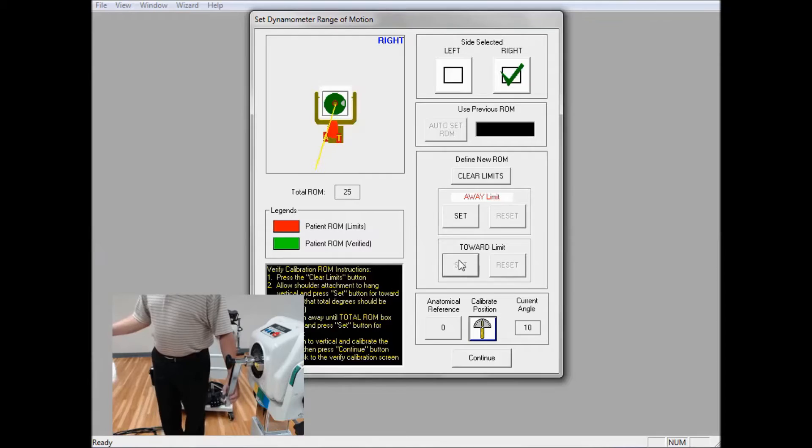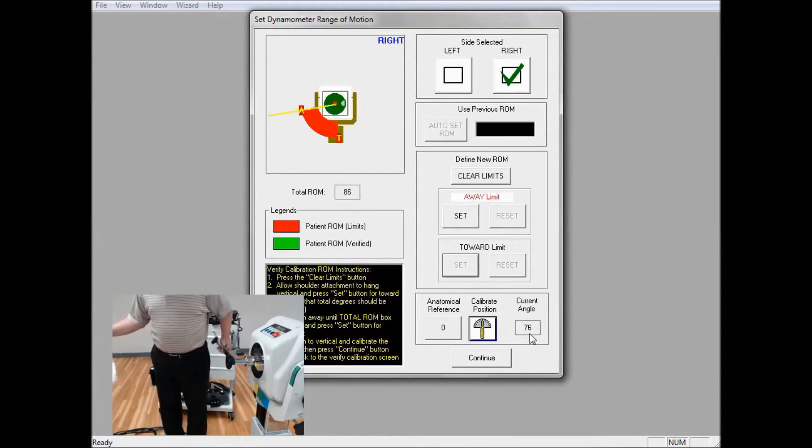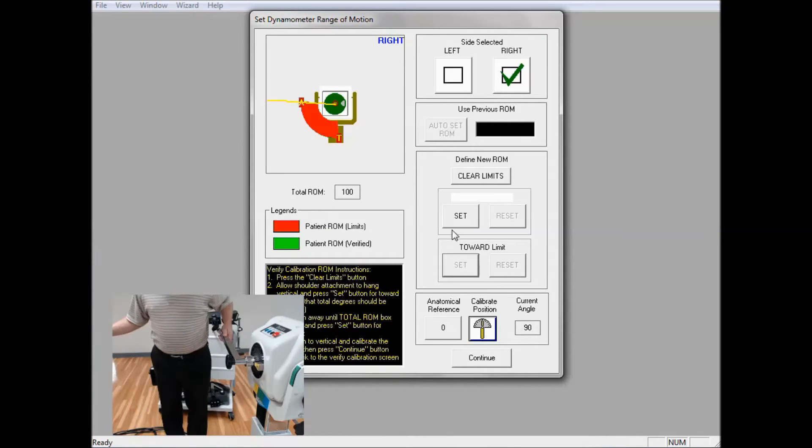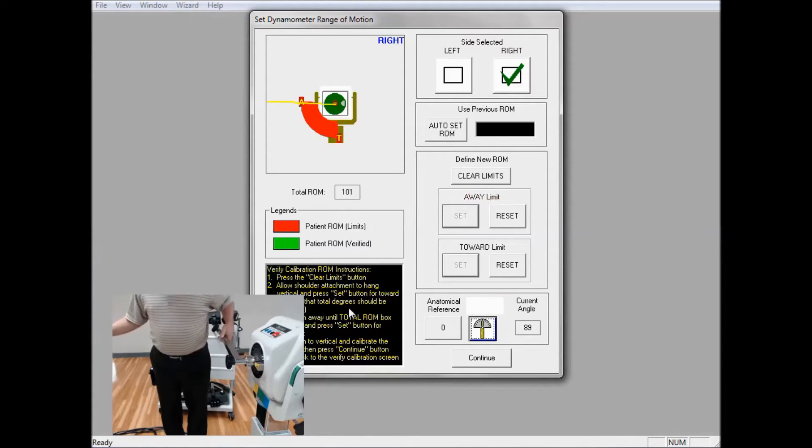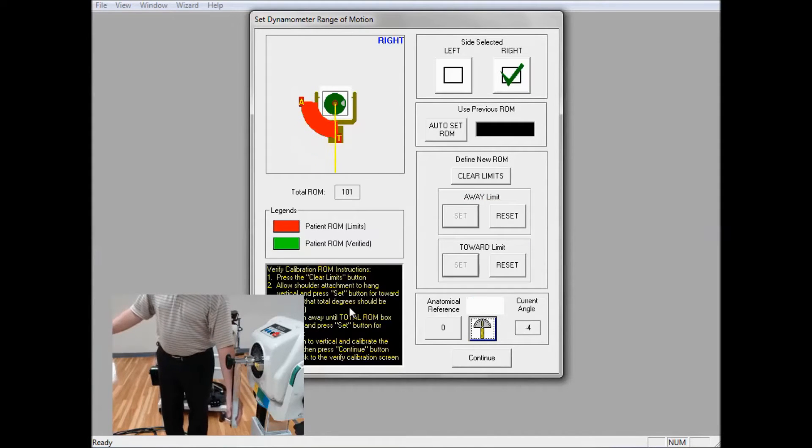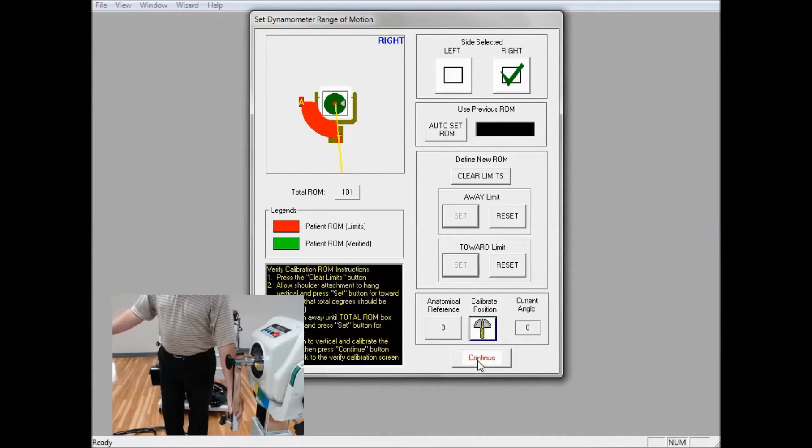And I'm going to raise it up, looking at the angle in the lower right-hand corner until I read 90 degrees. And I'm going to click on Away. I'm going to drop it down vertically. I'm going to Calibrate Position, and then you can click on Continue.